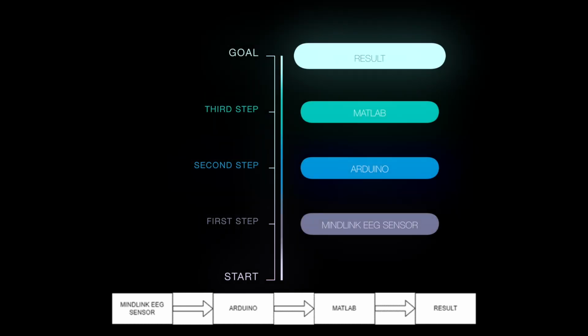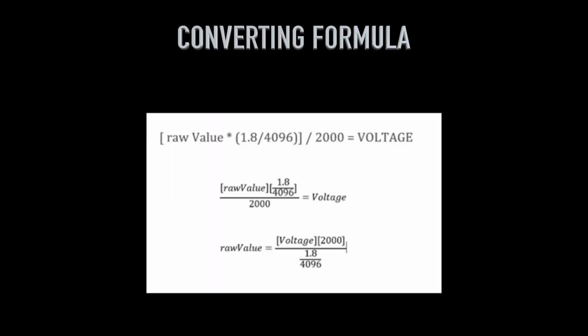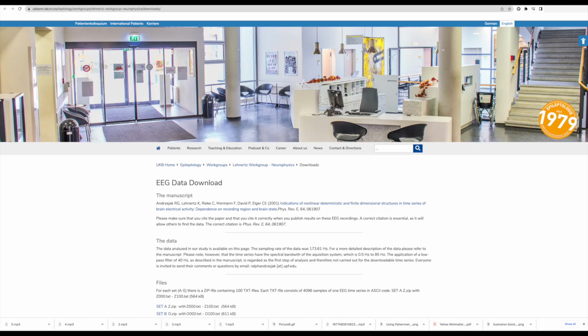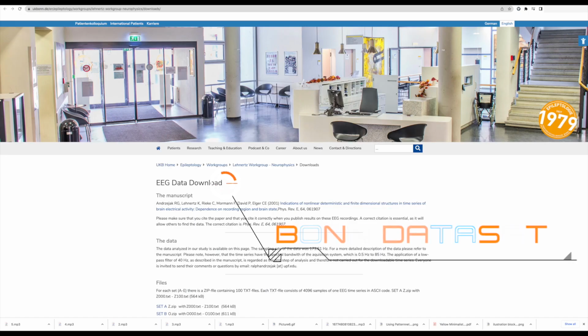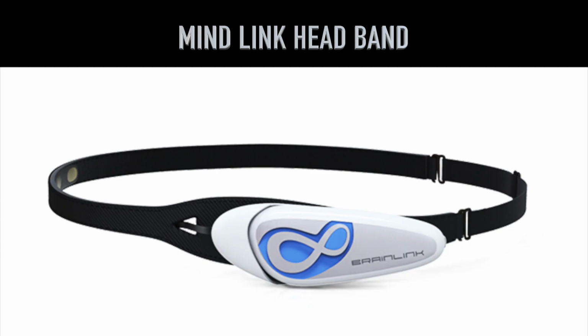As a result, the following is the project's goal. 1. To develop EEG data acquisition for medical application using MATLAB. 2. To determine which kind of input data should be used to explore epilepsy seizures detection and achieve the best results for use with a neural network. 3. To test and compare real brainwave data, obtained from the MindLink EEG sensor by using artificial neural network, ANN, using dataset University Bonn. Hardware development refers to three main components consisting of EEG sensor, Bluetooth module and Arduino Uno, which are combined to send and receive signals from the patient.